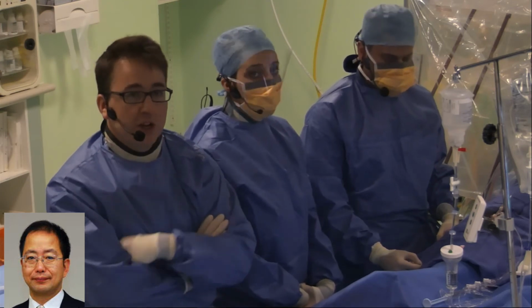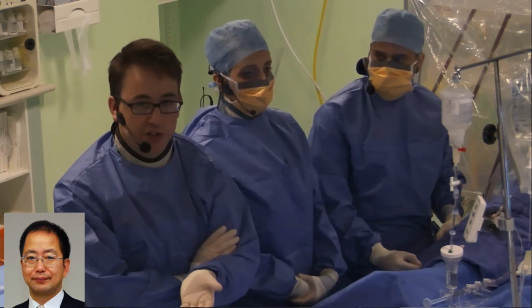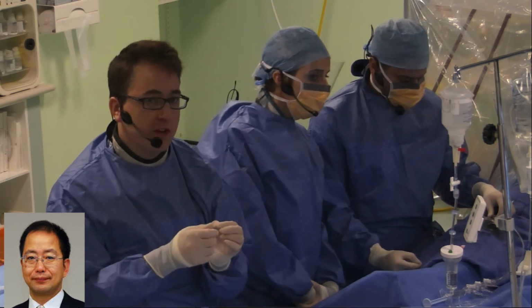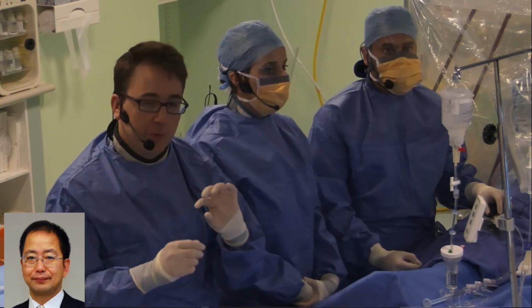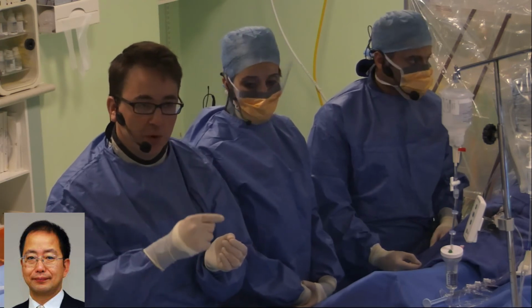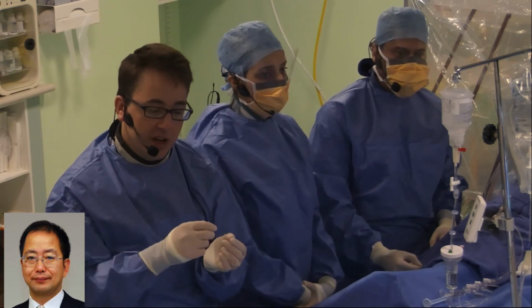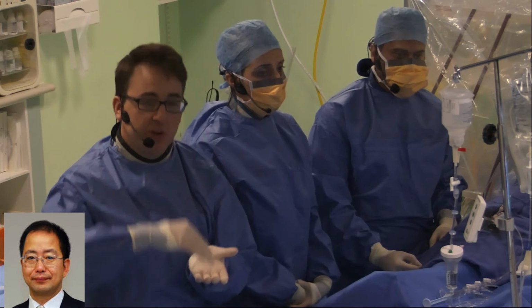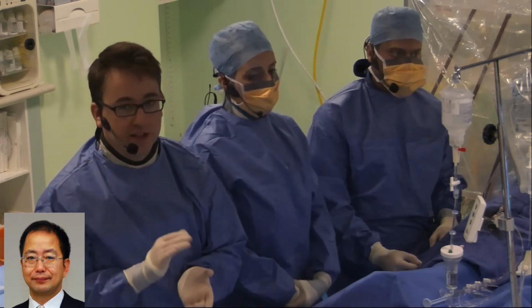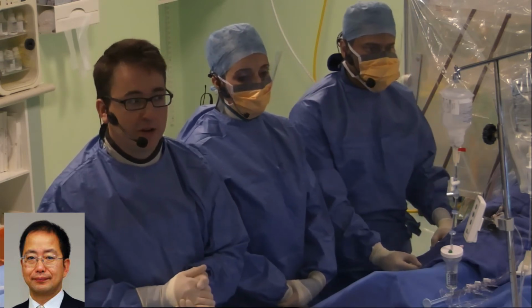No problem. Please go ahead. It's absolutely critical, and perhaps Hitoshi, it may be good to translate this as well, that the port must be done up. Don't feel like you have to undo the port a little bit. The port can be twisted shut because you can pull the pressure wire back very easily with the port done up. If the pressure wire is pulled back with the port open, the aortic pressure will move up and down, and you won't have an accurate FFR or iFR pullback. So that's very key, and it'll be excellent if you could communicate that to colleagues in Japan as well.